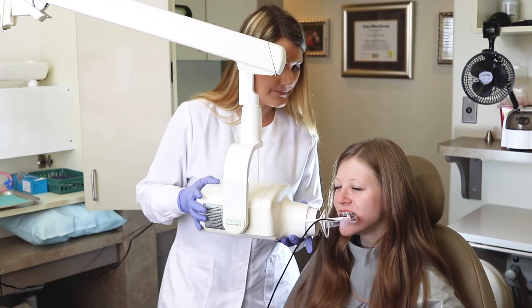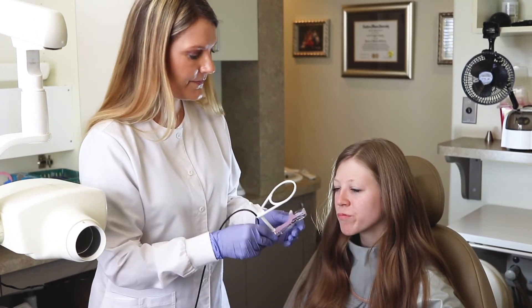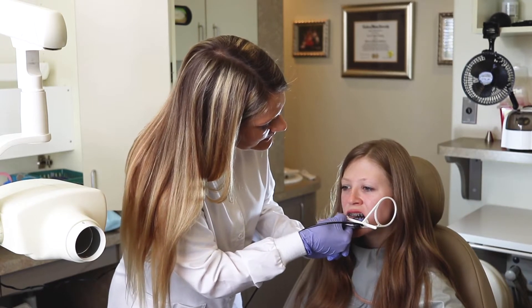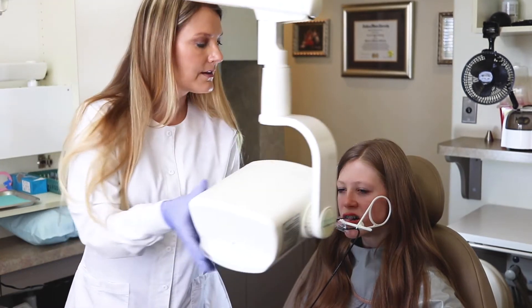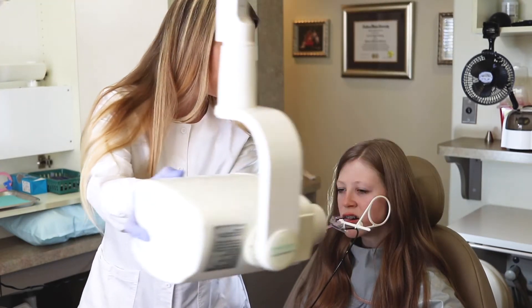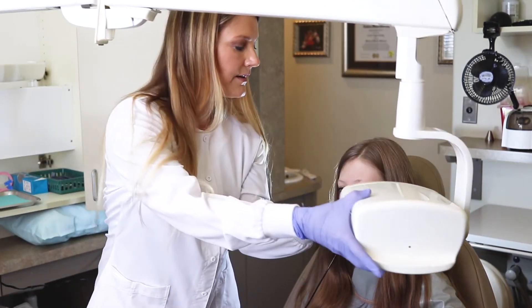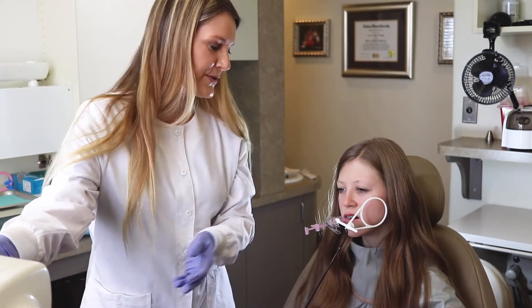We'll take another one here, and then we're going to go to the other side. We're going to open it up and start down. One in the back there — just move forward a little bit, about by ten, gently. We're going to take one there, and now we're going to move to the other side.